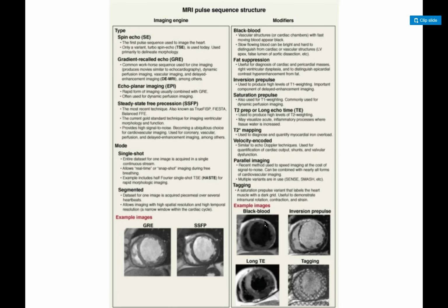So pericardium is another important thing that you want to see on these images. Myocardium you want to see on these images. Any structural abnormalities of the vessels you want to see on these images. The aorta is measured on these images as well. The aorta looks black and very nice with crisp adventitia, so you can measure those things on this.